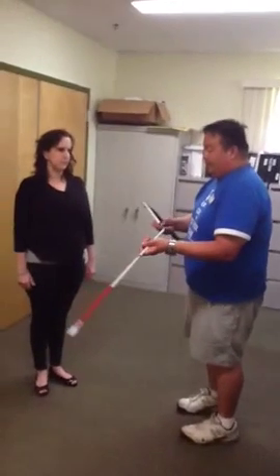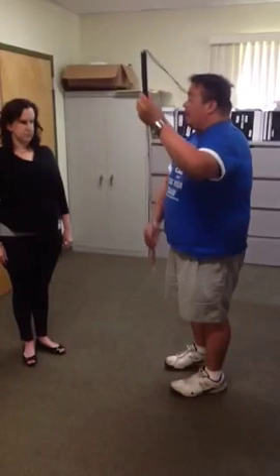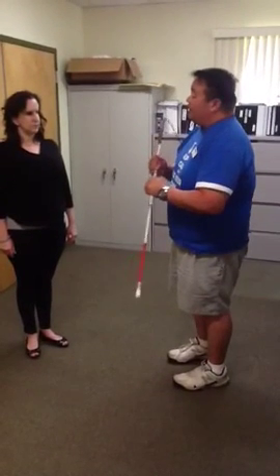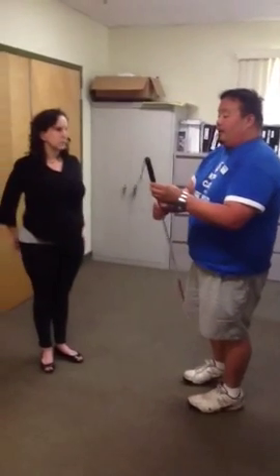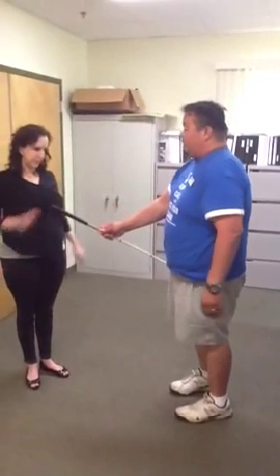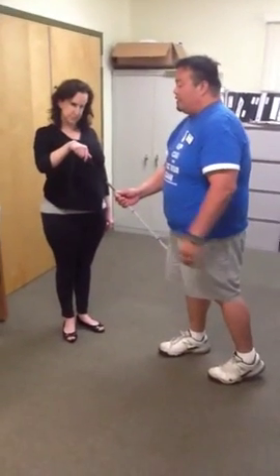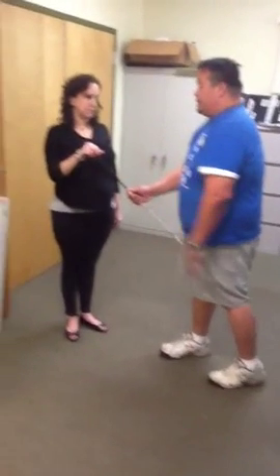It's lighter, but they both do the same thing. They fold. Now there's a straight shaft cane on here where it doesn't fold. The very top part of the cane is the grip. What the grip does is it's thick enough for your hand to hold on, but there's a flat part to the grip. Can you feel the flat part?